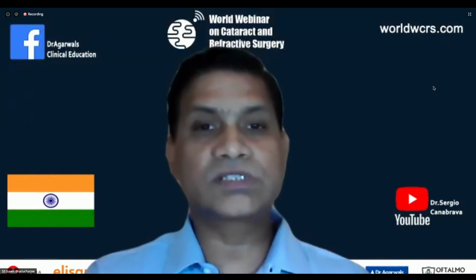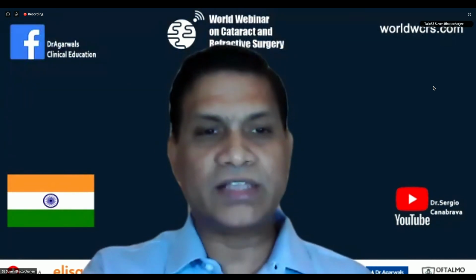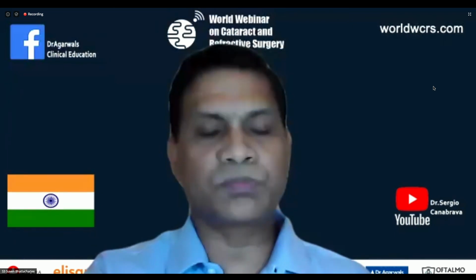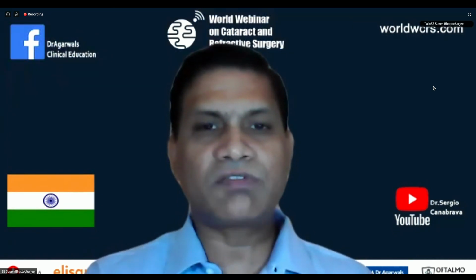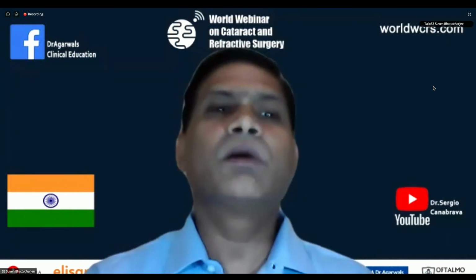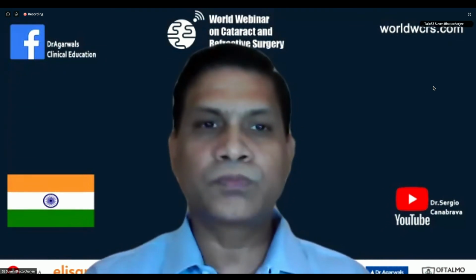With the B-HEX, since we are holding the flanges with the forceps, right at the flange, the control is a lot more. As you tuck the flange under the pupil margin and advance it towards the periphery, the confirmation is immediate. If you have a resistance, you can see that the capsulorhexis has been engaged, so you withdraw and go at a plane slightly higher. So that is an advantage with the B-HEX. And as you said, it's a planar device, so it goes in much easier, and you can see the notches which are flat and staring at you.